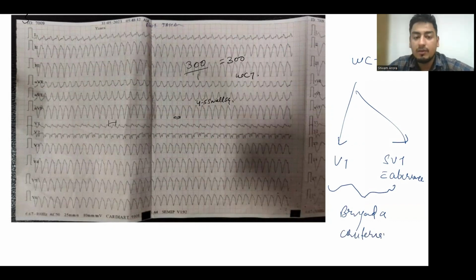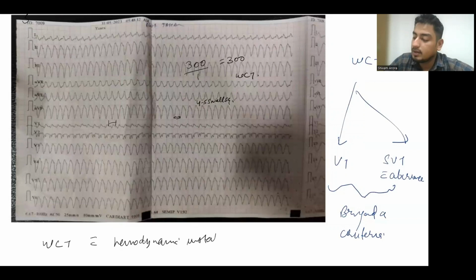But one thing you have to know for sure is that any wide complex tachycardia with hemodynamic instability should be treated as VT until proved otherwise.